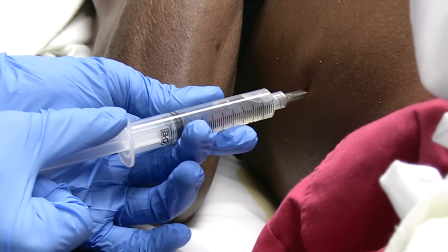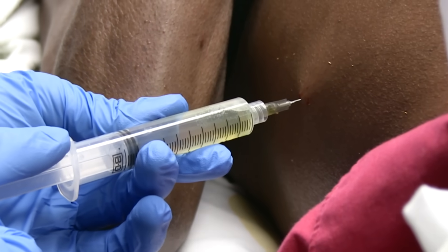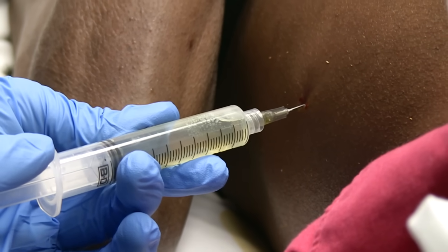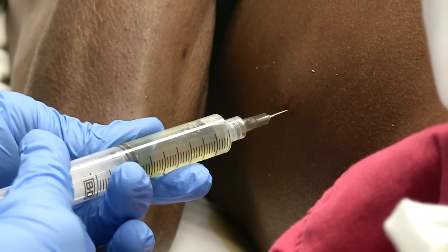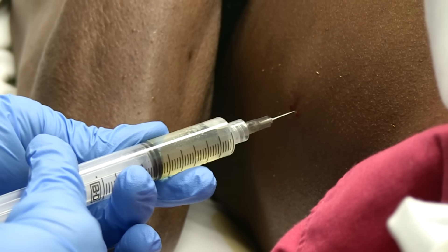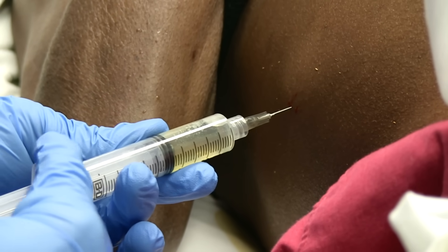Are you injecting as you're going in? There's fluid — pull back just a bit as you aspirate. Stop — you can't aspirate anything now. Deposit anesthetic there; that's the peritoneum. The peritoneum is also very painful, just like the skin. So you want to anesthetize both the skin and the peritoneum to minimize pain with the procedure.